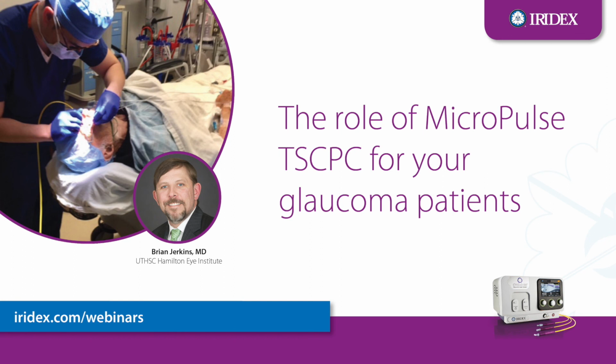But I think this is a big technique of making sure you do give a little bit of lip between the limbus and the probe, and definitely avoid 3 and 9 o'clock, because if you do get close to 3 and 9 o'clock, or you're hugging the limbus a little bit, I think SPK can be an issue. The stem cell thought is a great idea. I can't say yes or no to that. I've always felt it was more due to getting a little bit close to 3 and 9 o'clock.